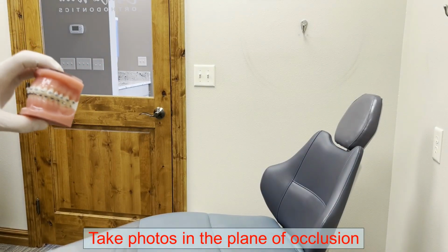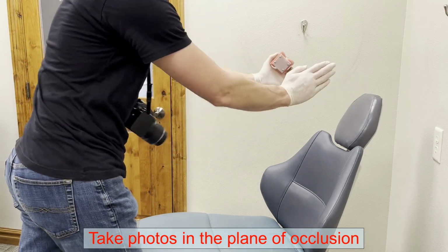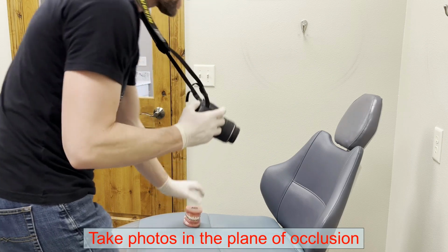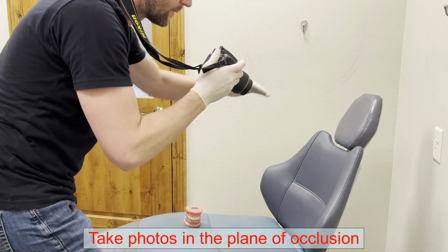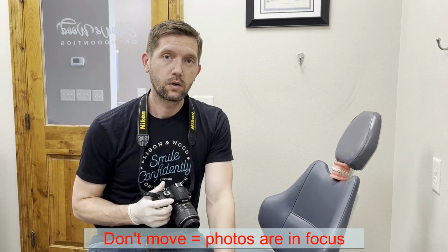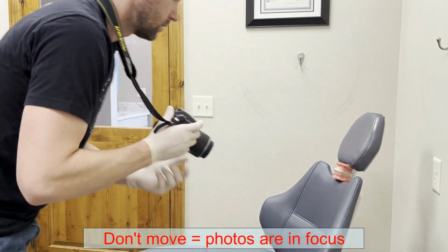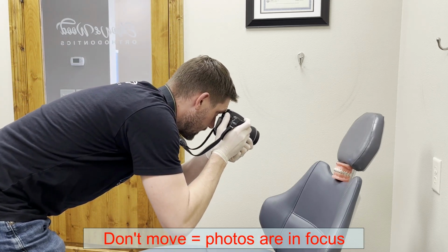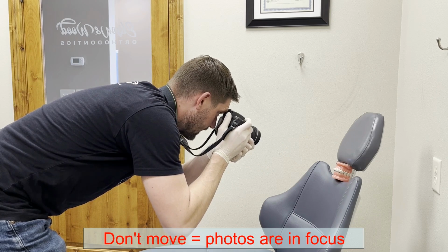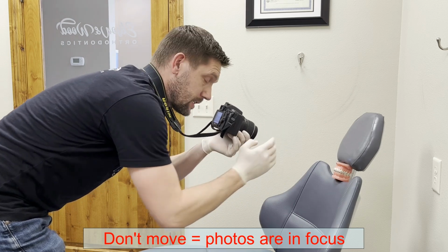So the way that I achieve this in the chair is I'll have the patient rest their head back against the headrest and then turn toward me slightly, and then I will adjust my height to get exactly on that plane of occlusion. So it's very important that your photos be in focus. To make sure that they're in focus, this is what you want to do. You get your shot all set up so that when you're looking through the viewfinder, it's exactly how you want it. And then you push the button halfway down, you'll hear that beep, and whatever the little square that lit up inside your viewfinder, that's what it's focused on.